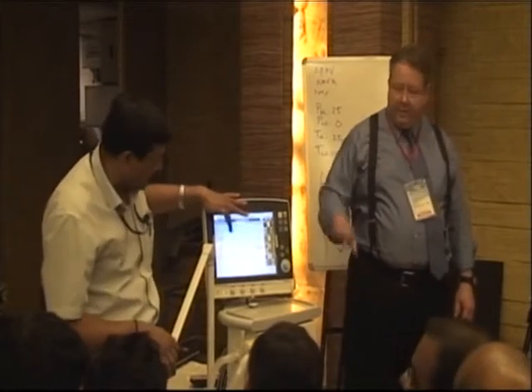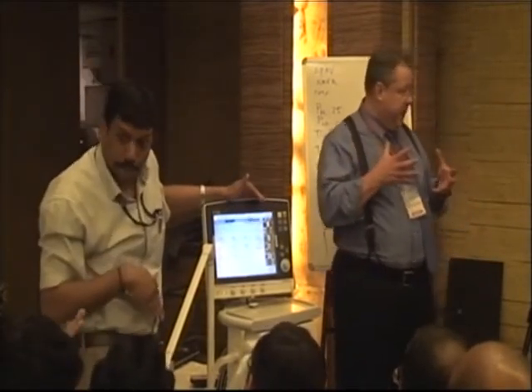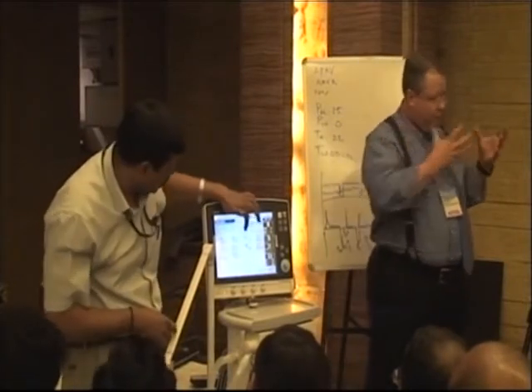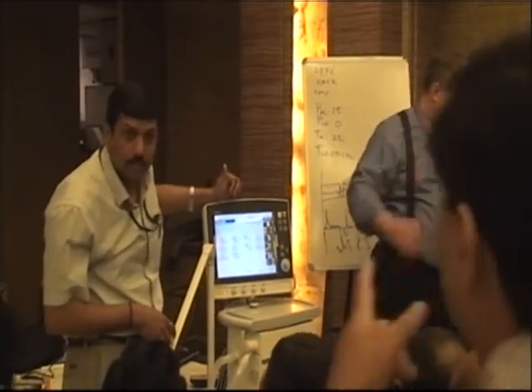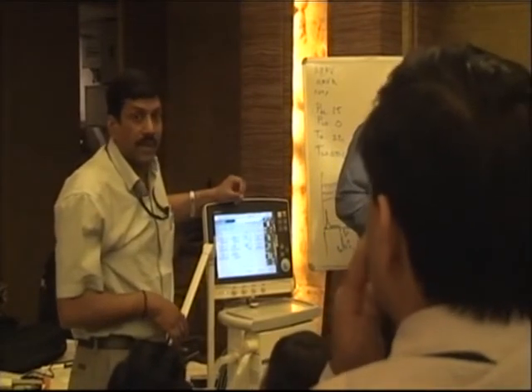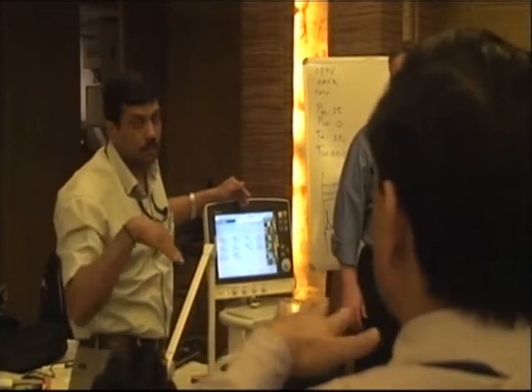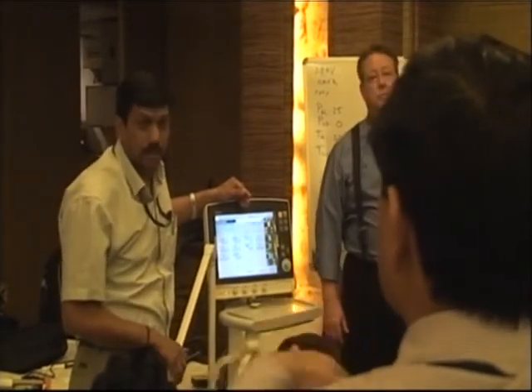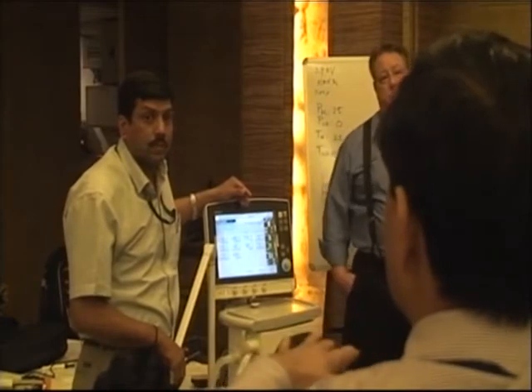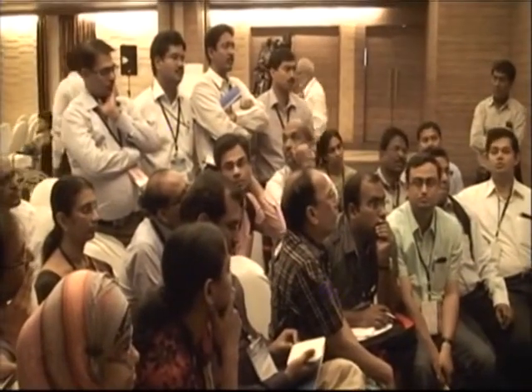The machine will give those cycles, and the patient can breathe on both CPAP levels. BiPAP is very challenging. All the breaths are patient-initiated breaths. The patient can initiate a breath, but the machine will support on both the CPAP levels. The machine is supporting the pressure, but it is not initiating breaths like SIMV or IMV. It is only the cycling pressure that is maintained, and the patient will have his own spontaneous breaths.